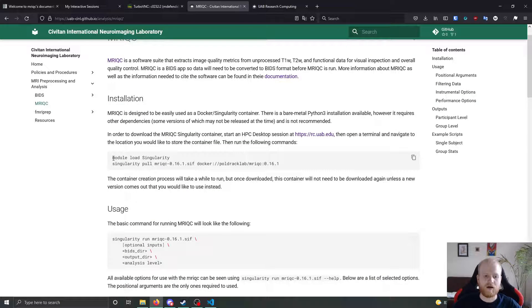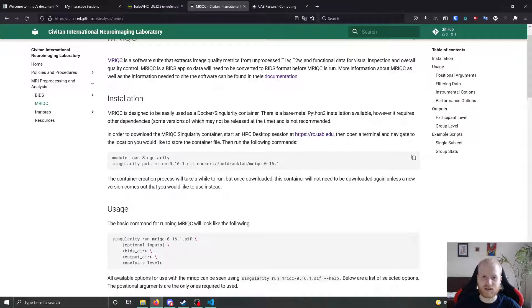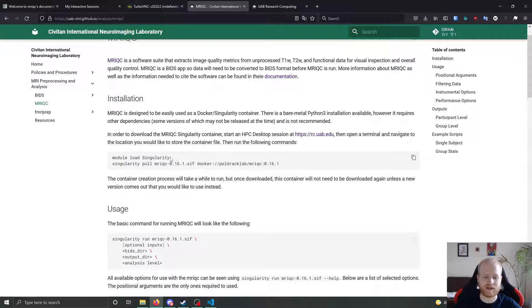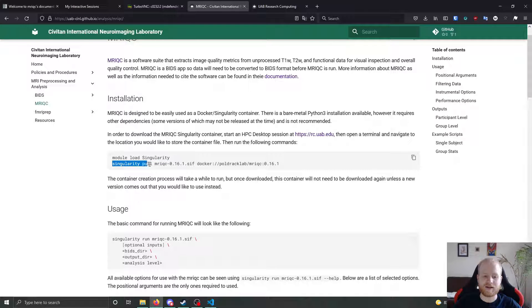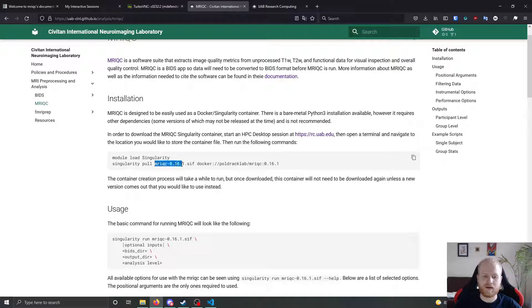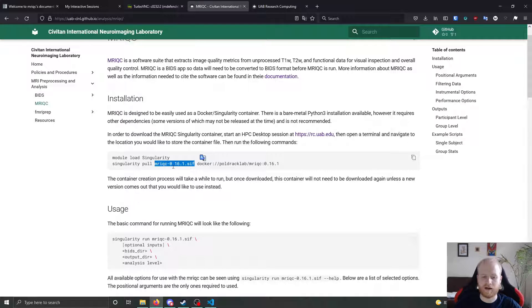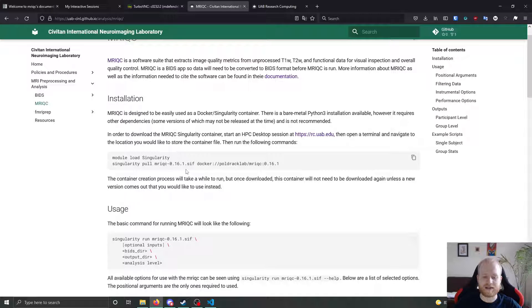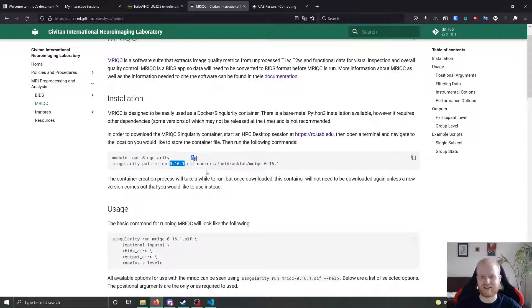Like I said, MRI QC is hosted as a Docker container on Docker Hub, but we're going to download it using singularity. Luckily, it is very easy to download. All you need to do is get an interactive session on Cheaha and bring up a terminal, use module load singularity to load up the singularity capabilities, and then run singularity pull.